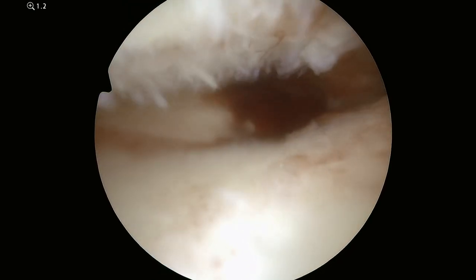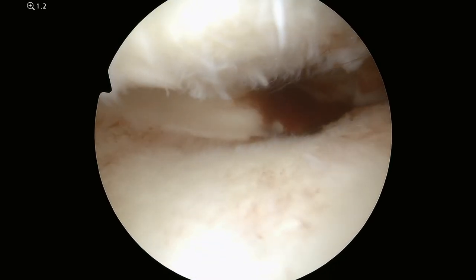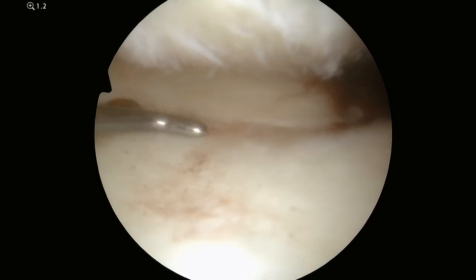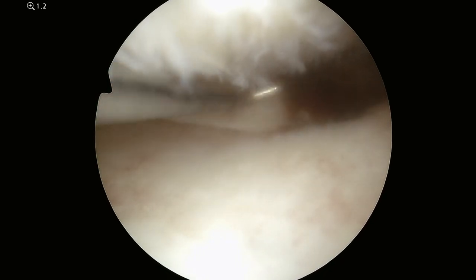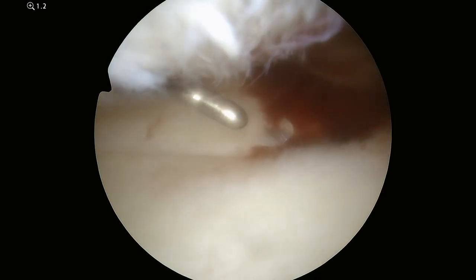This is after the tunnels are secured and you can see now where previously the meniscus was floppy and moving all over, now there's a stable point that the meniscus is fixed to. This will allow it to adequately absorb shock while you're walking.